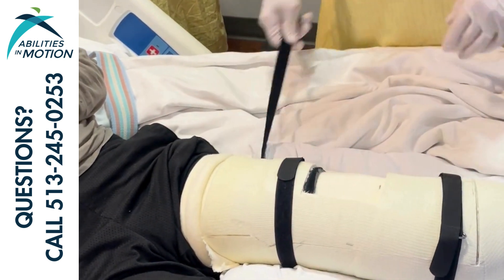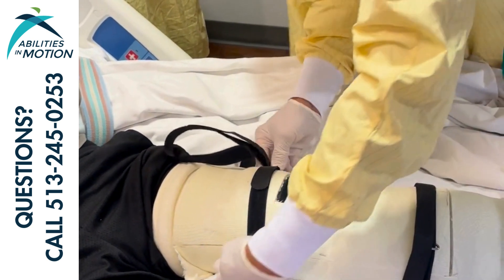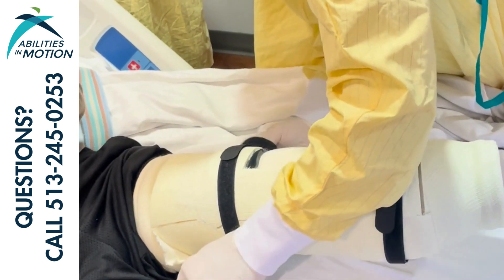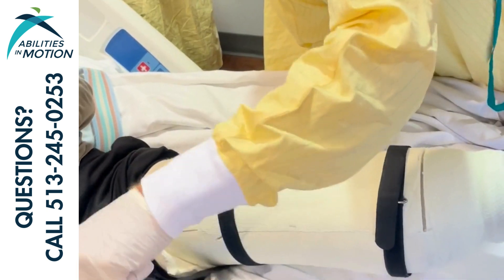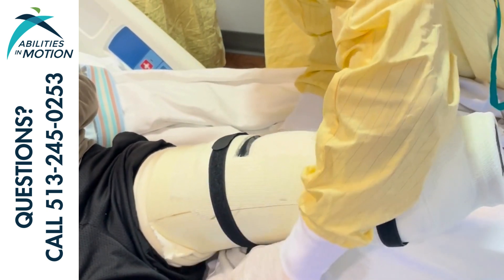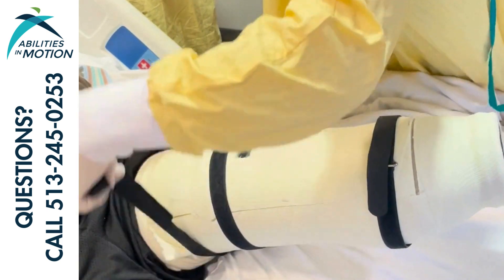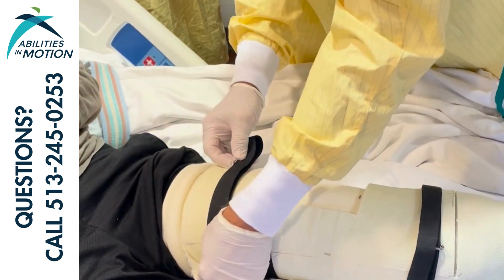We want to push the edges together and make sure that it's on there nice and snug. We do this instead of yanking on the straps to prevent any damage to the straps and to provide the best fit. Make sure you're pushing down with your hand to compress the lid down on the base.